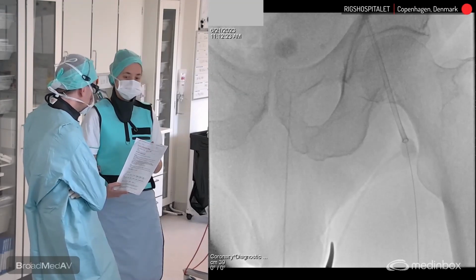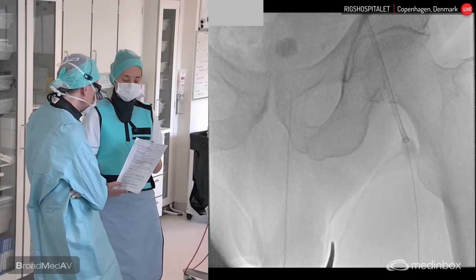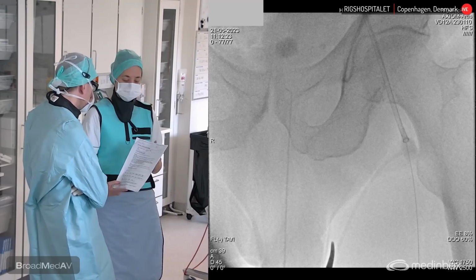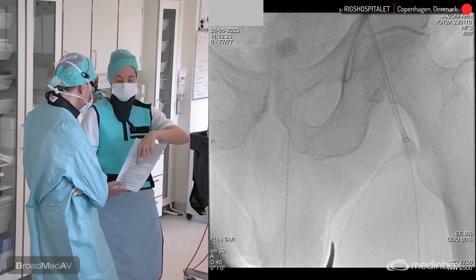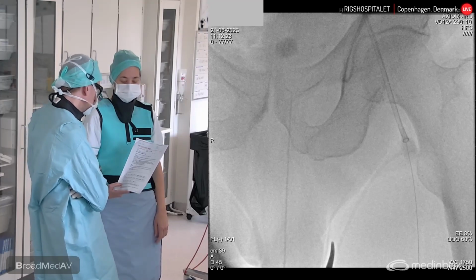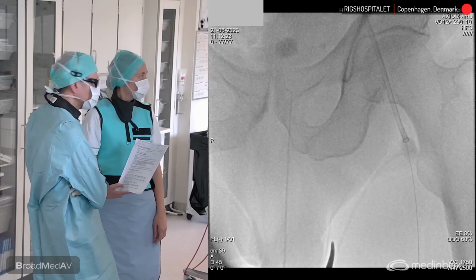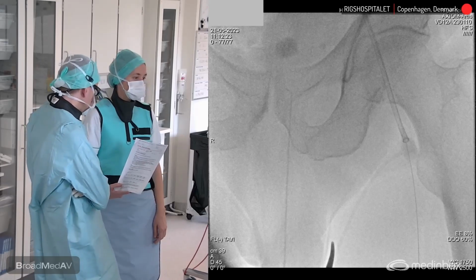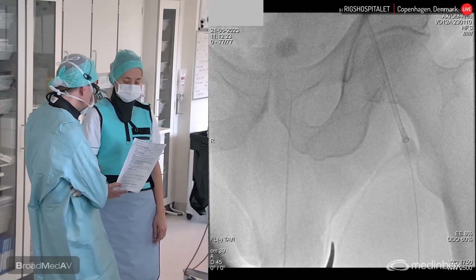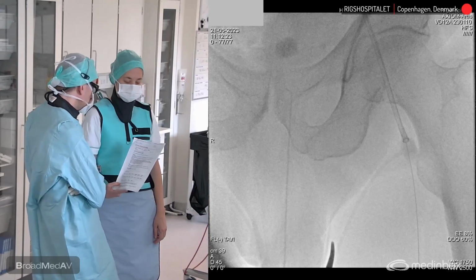Then he had a coronary angio that showed a closed intermediate vessel. He had a stenosis on the LAD, which was RFR apparently negative or what? Yes, he was positive because it was 0.69. He got PCI of the LAD before, and now he's on double antiplatelet therapy. His renal function is preserved. His ECG looks fine. PR is normal, 140, QRS 104.